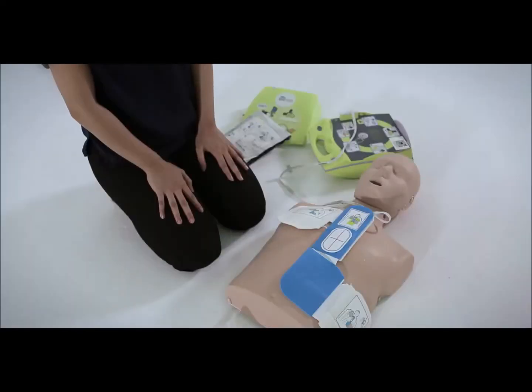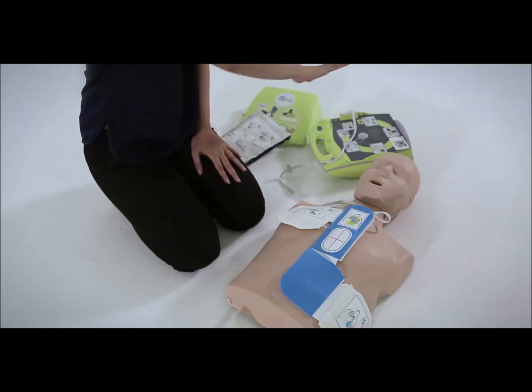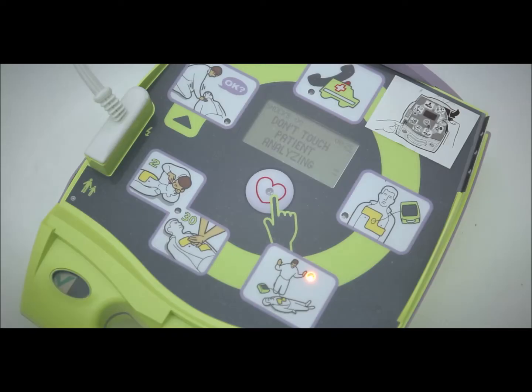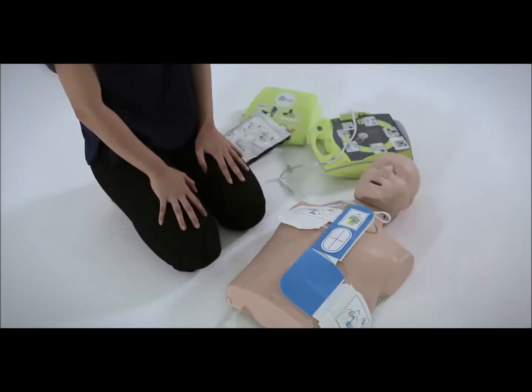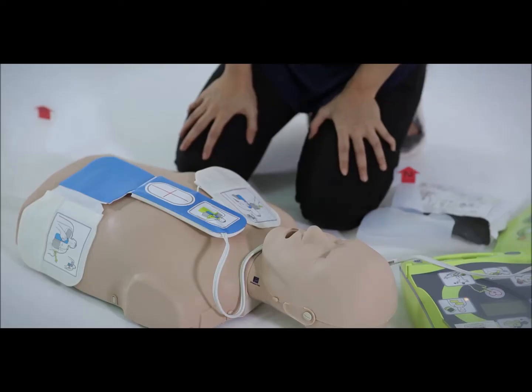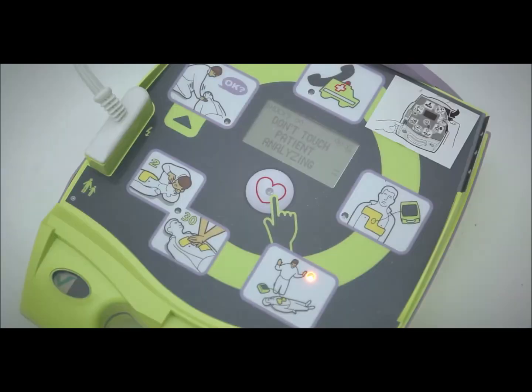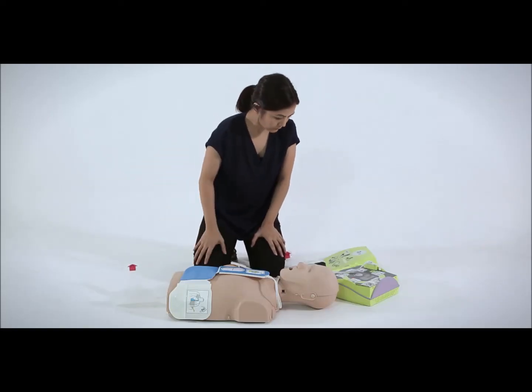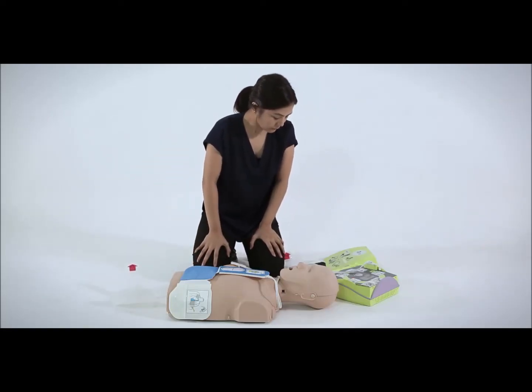You should not touch the victim at this point, and the AED will remind you not to do so with the prompt: 'Don't touch patient, analyzing.' The AED will determine whether the victim can be treated using defibrillation. If this is possible, the AED will announce the shock advisory, then remind you to maintain a safe distance and make sure no one is touching the victim before pressing the shock button.